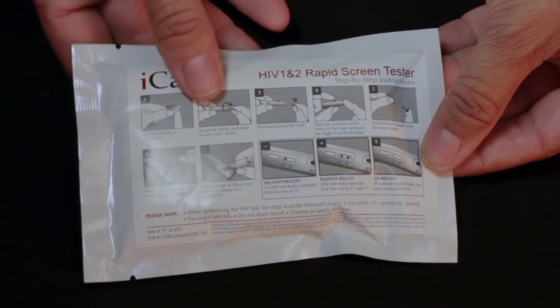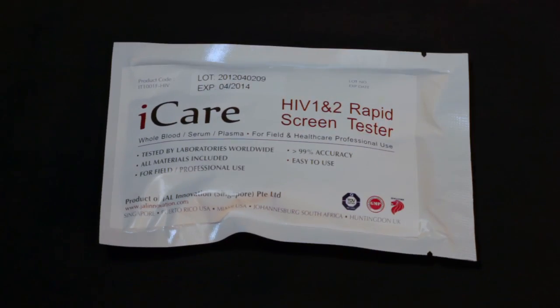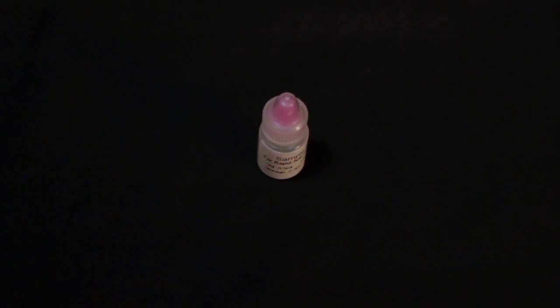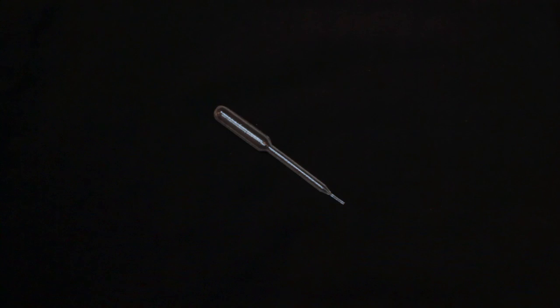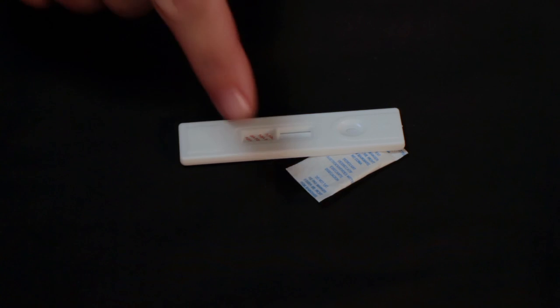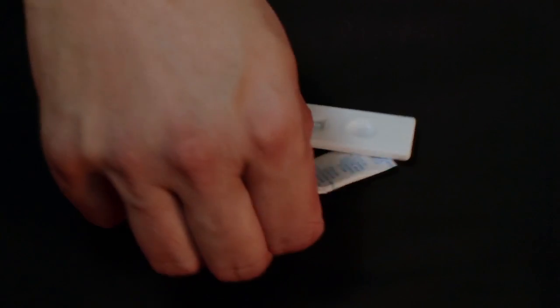Since no test or kit is infallible, it is best to confirm test results by using a licensed medical testing facility. Inside the package, you will find an alcohol prep pad, lancet, dilutant bottle, micropipet, and a pouch containing a plastic test device and a moisture-absorbent packet. The packet is not used in the testing process and should be discarded.